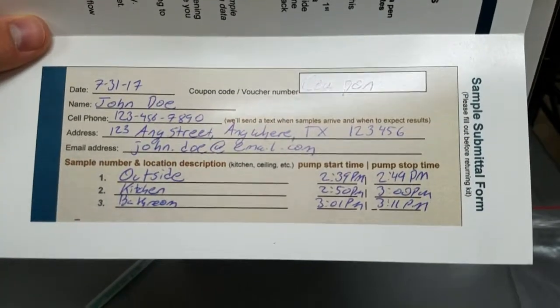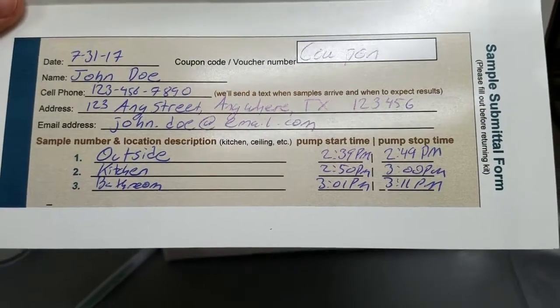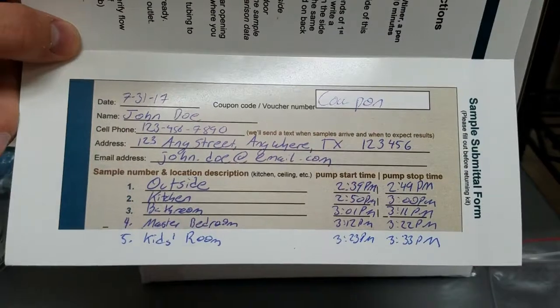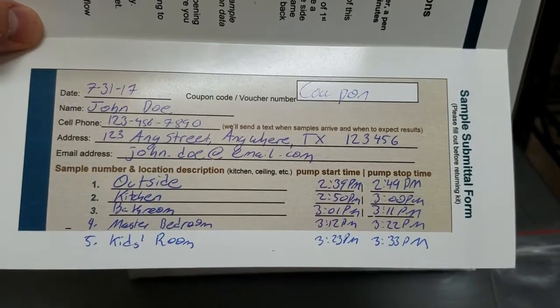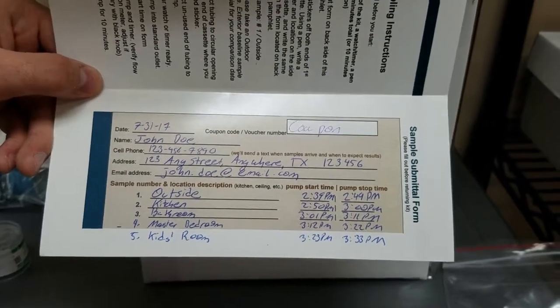Do the same thing for your other two locations. As an example, this is what your form should look like after you've taken all three samples. If you do use the two just-in-case cassettes, make sure to add in the sample information on your pamphlet as well.